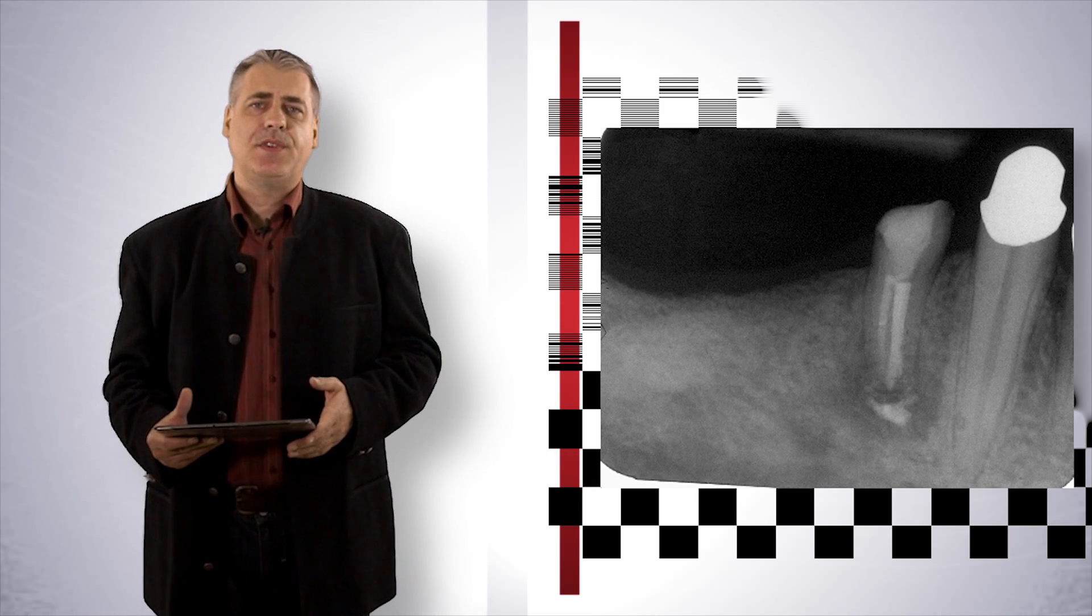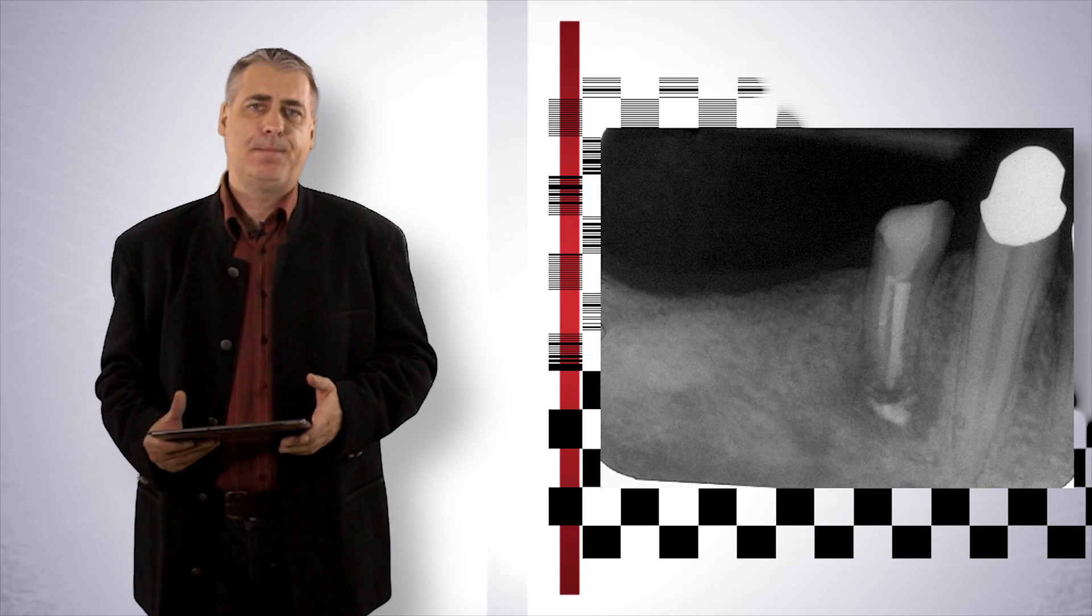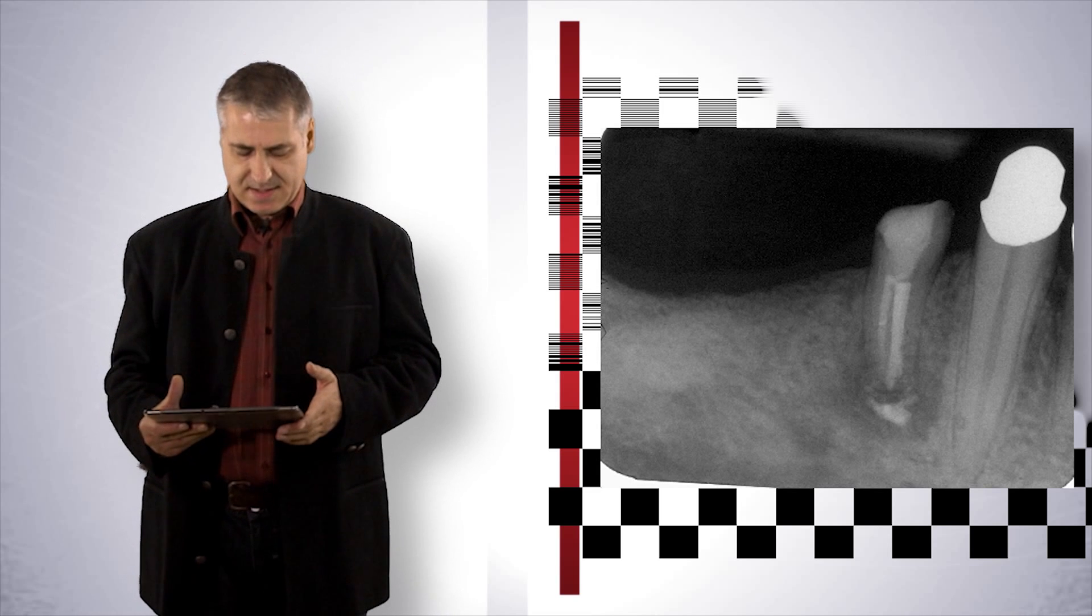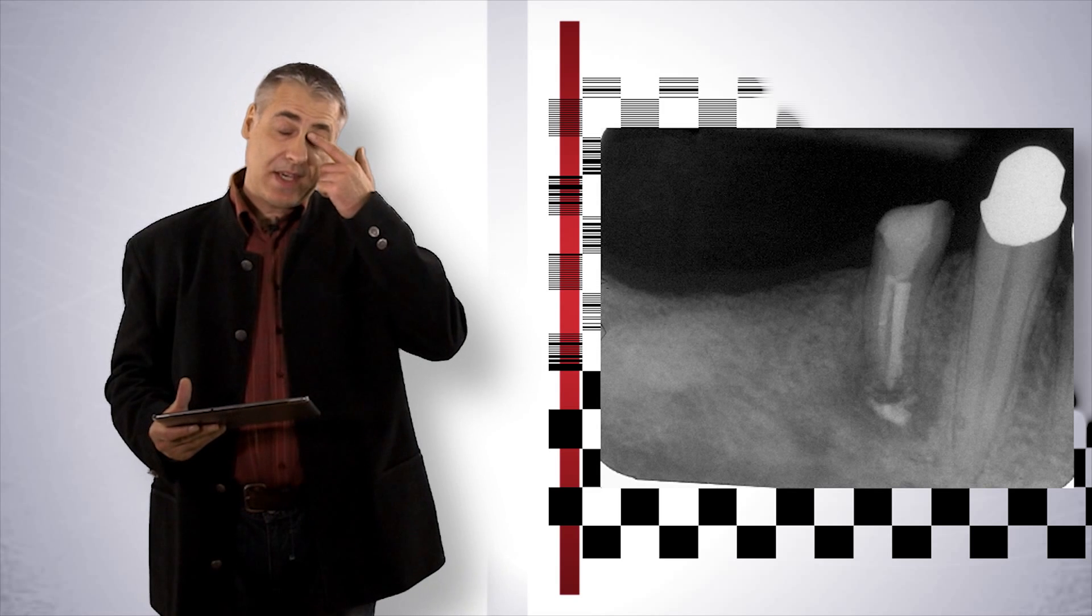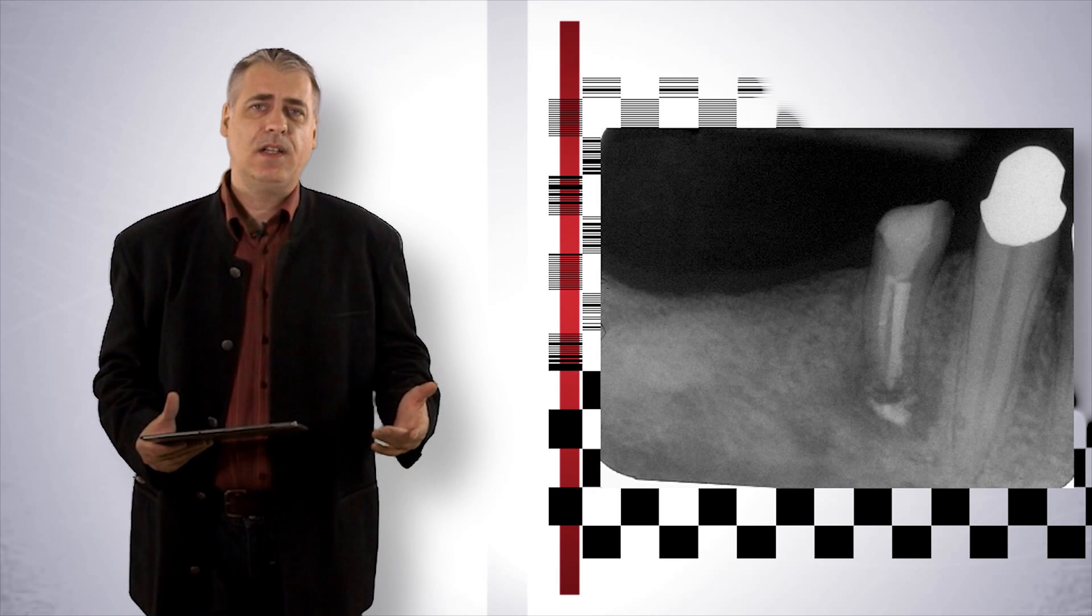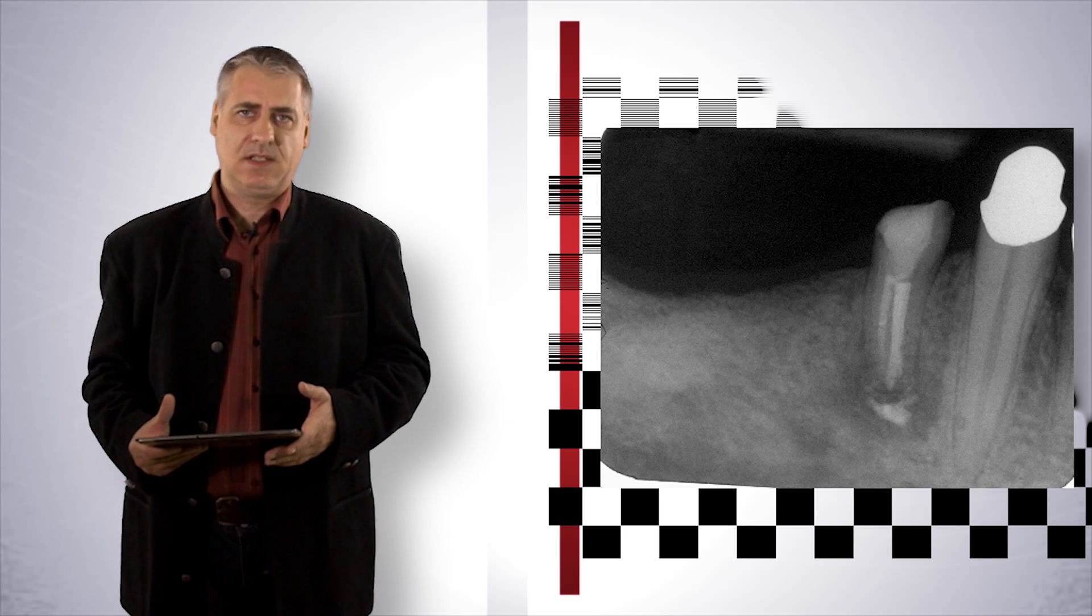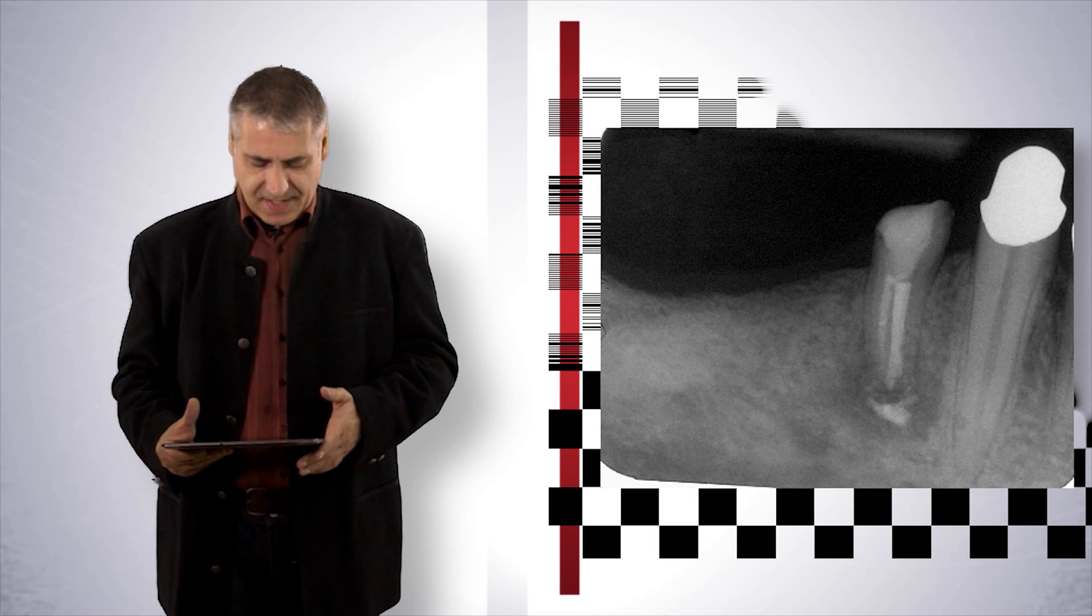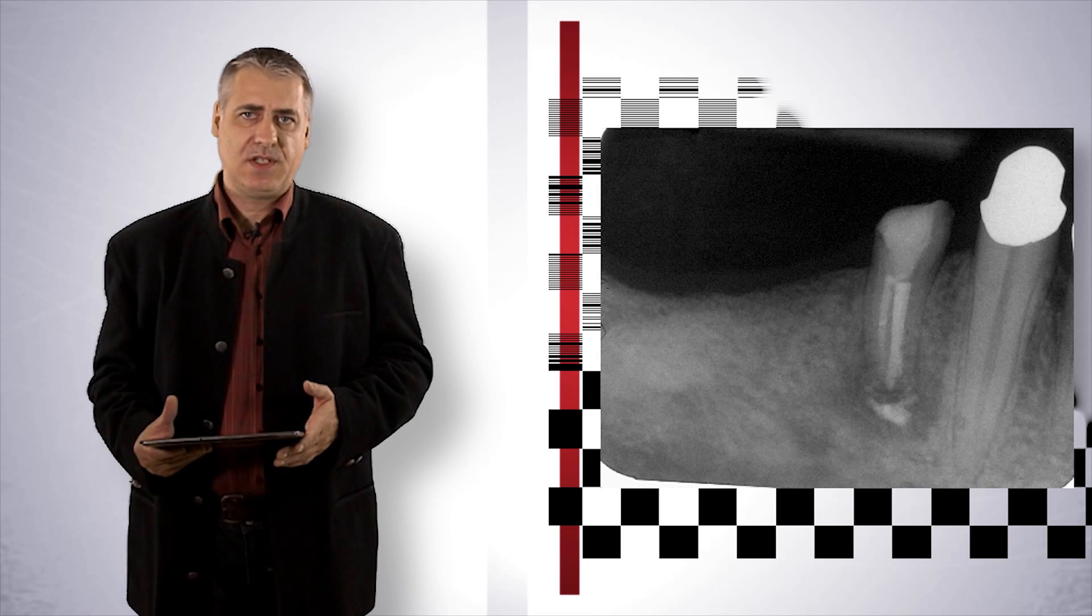After a final copious irrigation an MTA plug was placed at the end of the buccal canal because it had this wide open apex. Then gutta-percha was placed with warm vertical condensation in the lingual canal and I used a squirting technique in the buccal canal after the MTA was set. The access cavity was then filled with a dentin adhesive filling material.